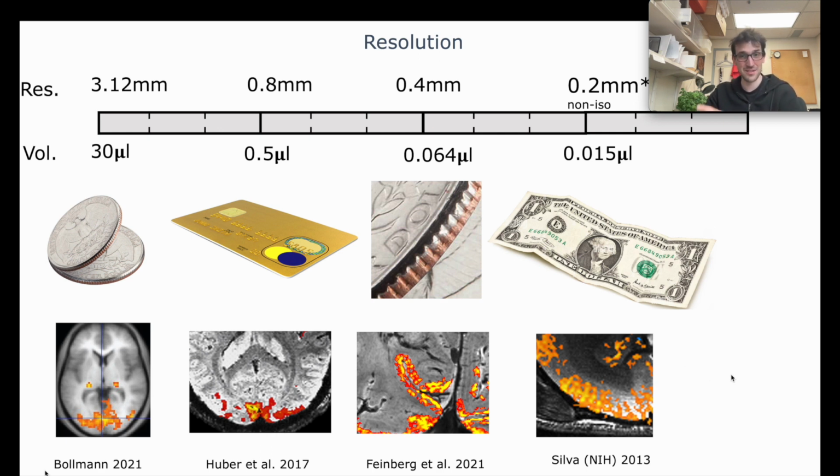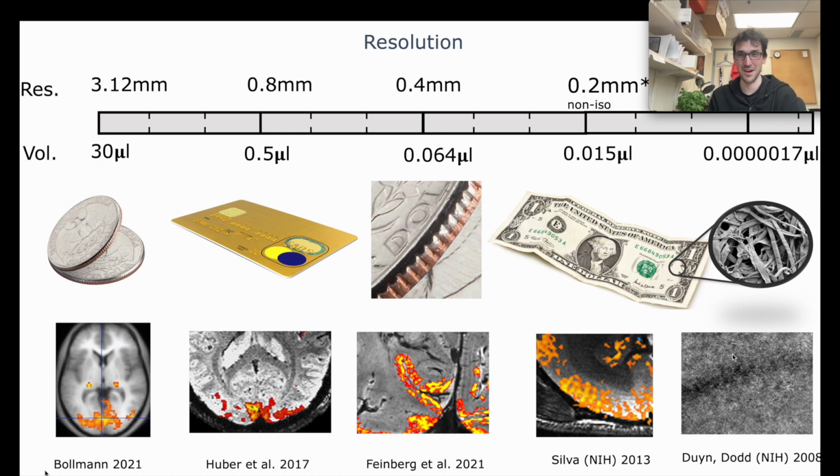And when you look at the structural imaging results that are published out there, you can go to 12 micron. That's many orders of magnitude smaller than what you can do, for example, here for functional imaging. So, of course, with structural imaging or ex vivo here, you can scan longer, right? You can scan an entire weekend if you want. Though a weekend is not that much longer in the sense of orders of magnitude. For example, a weekend has like 50 hours, and 50 is just 7 squared.